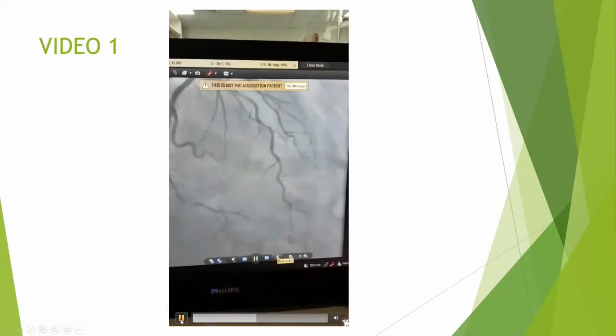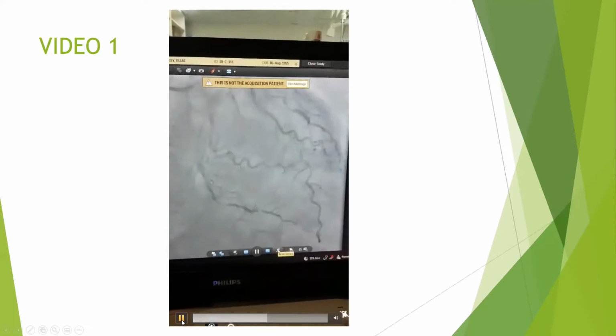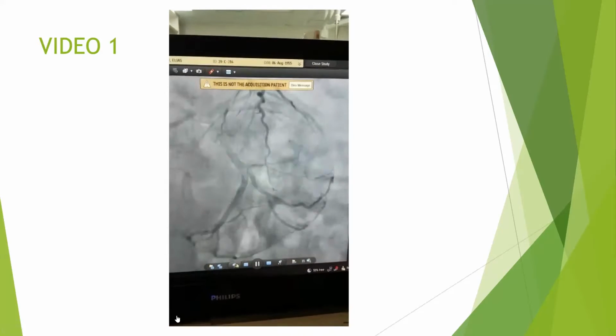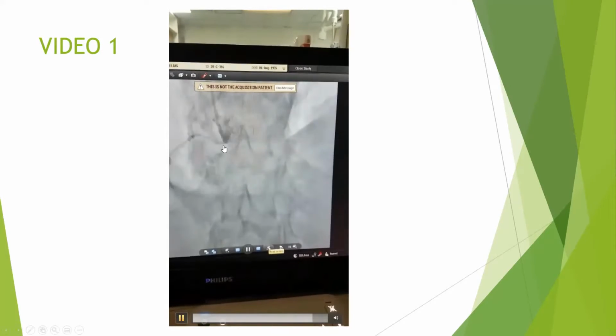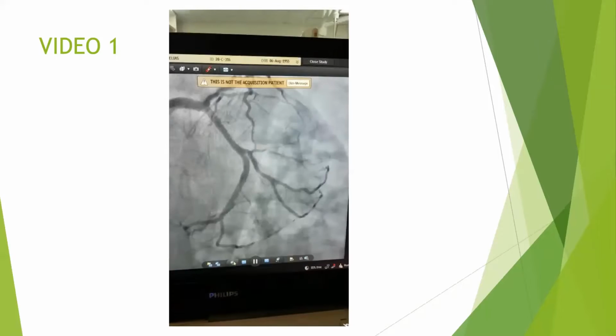So here is the distal circ lesion. And he had a small RCA, which we'll show you in other views. Small RCA, some disease, so it's also medical therapy since it's a small vessel. But the patient came back to me 2 years later complaining of significant exertional angina. This is limiting his daily activities. And so we decided to repeat the cardiac cath for him.